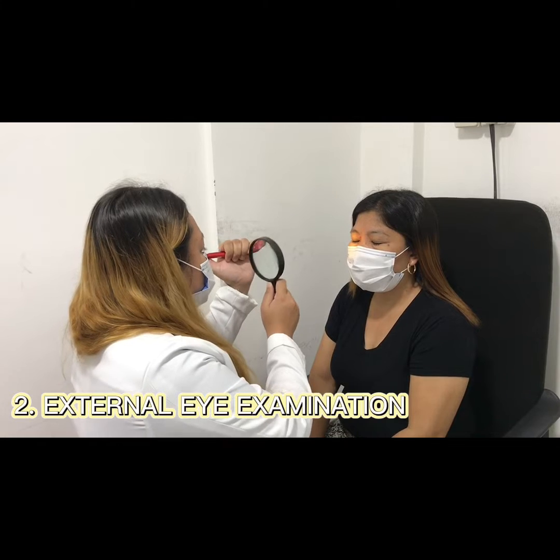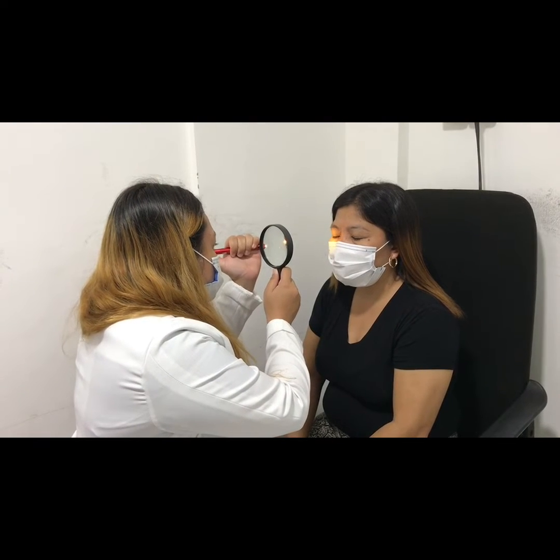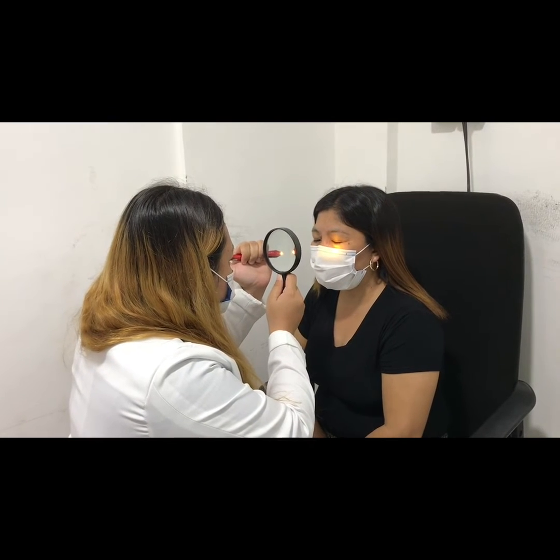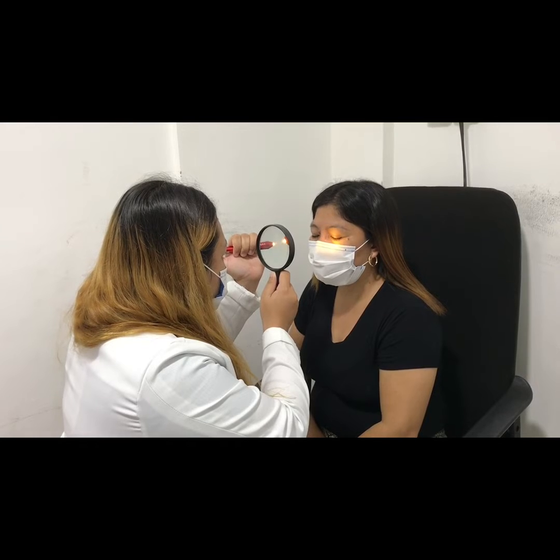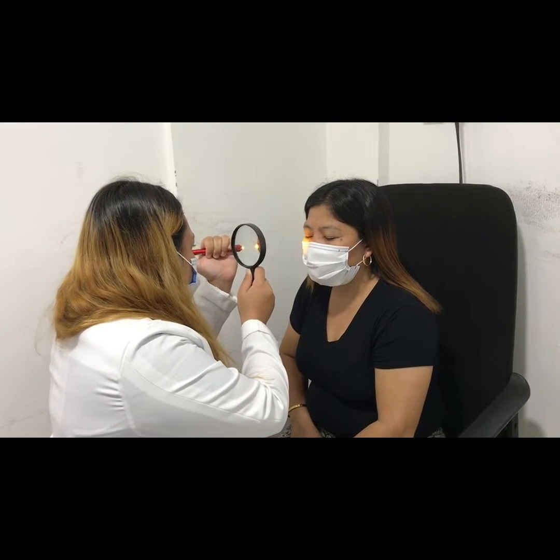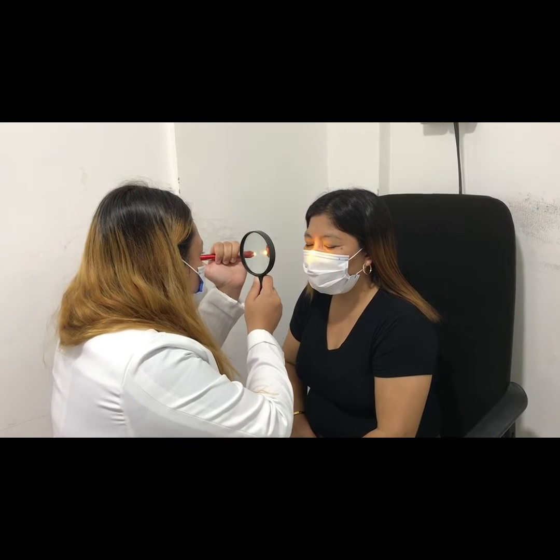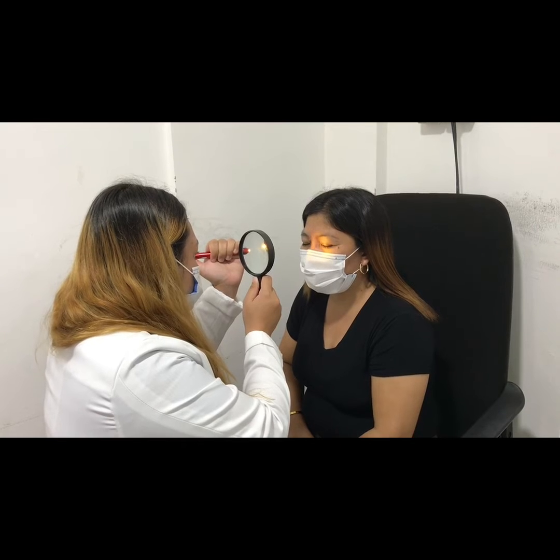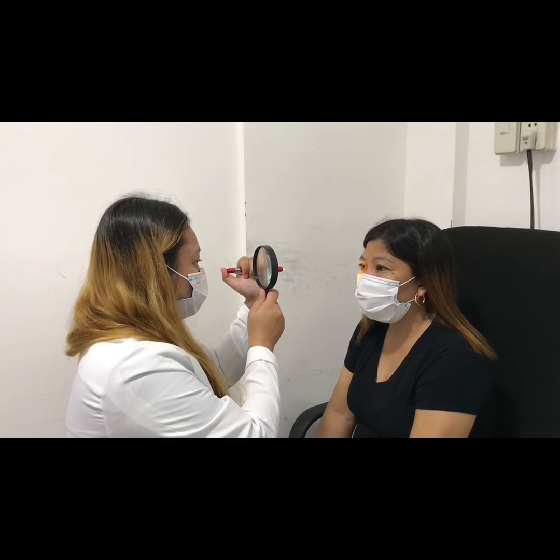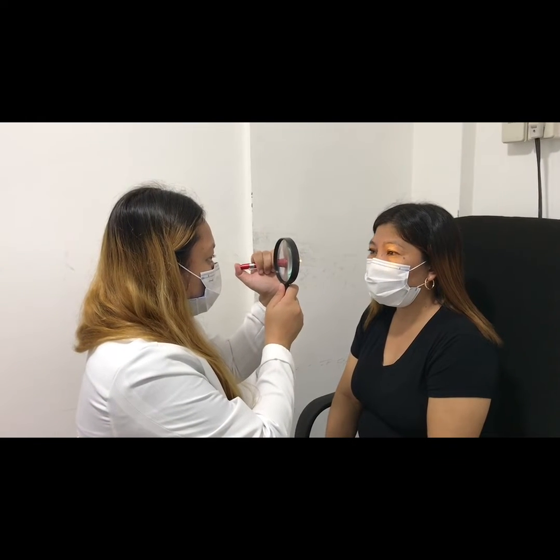Number 2, external eye examination. To check her eyelashes, I instruct the patient to close her eyes for a while. Eyelids, I instruct the patient to look at my nose, and I inspected it using a pen light and a magnifier.